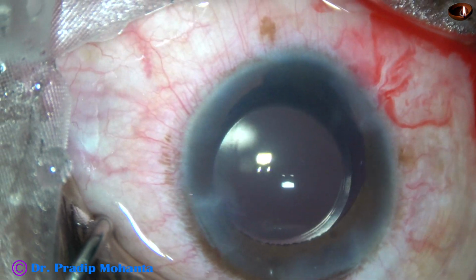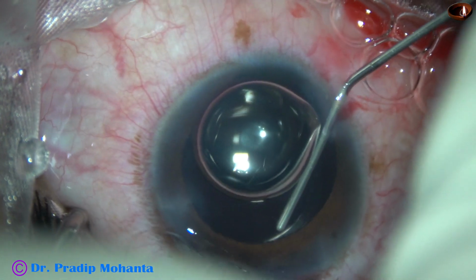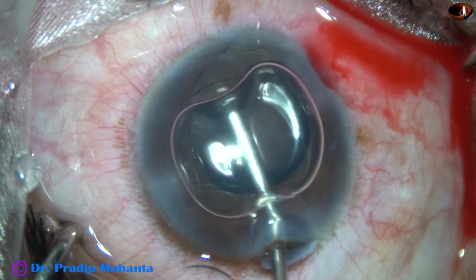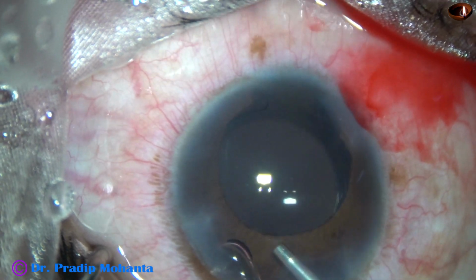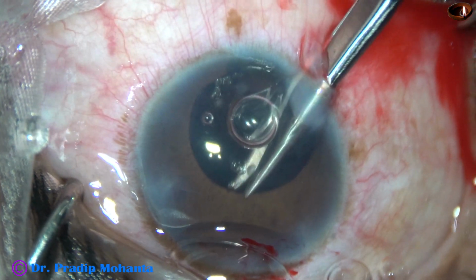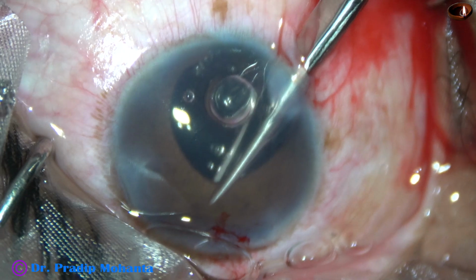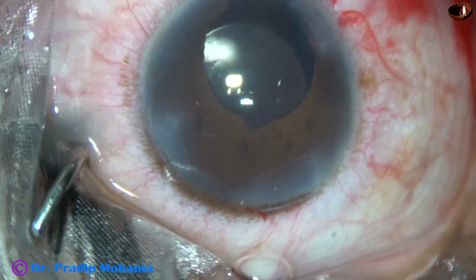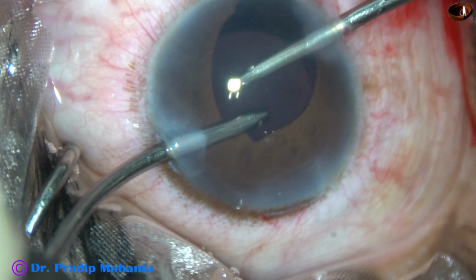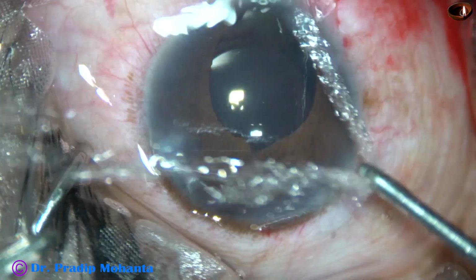And now my plan is to do sphincterotomy for this patient. So I inject air, then inject pilocarpine under the air, wait for 2-3 minutes, and then replace the air with visco. And now I take a Vannas scissor, go through the 7 o'clock side port. We can use a micro scissor if we have a smaller side port, and do this sphincterotomy. This has been done because in normal situations the upper border of the pupil comes down and covers the visual axis. And now this is the final cleaning of visco.